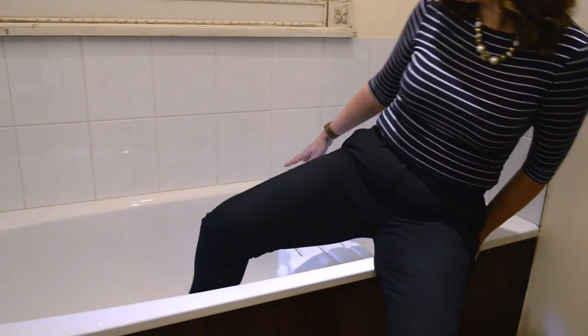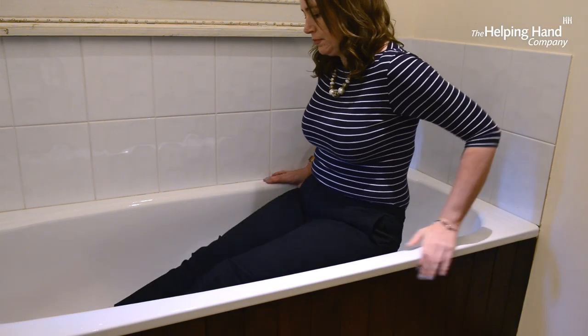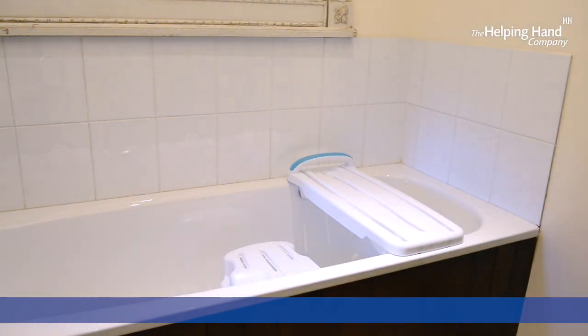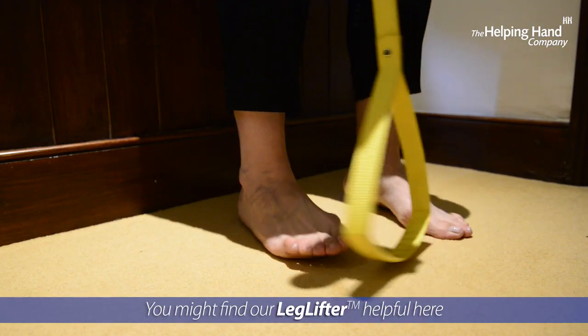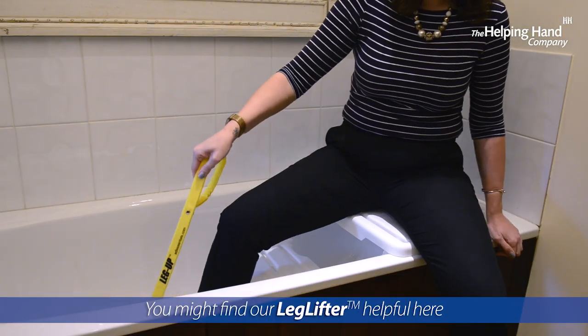Here is Charlotte showing you how to safely get into, down and out of the bath, either using the bath bench board or seat or a combination of. You can see here you might also find a leg lifter helpful to be able to raise your leg for getting in and out of the bath.